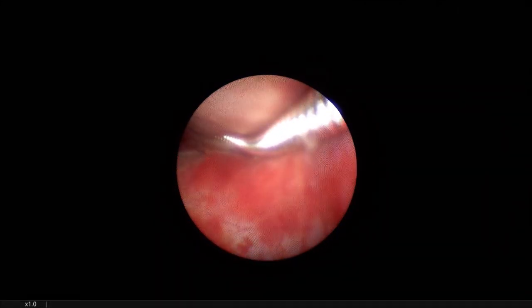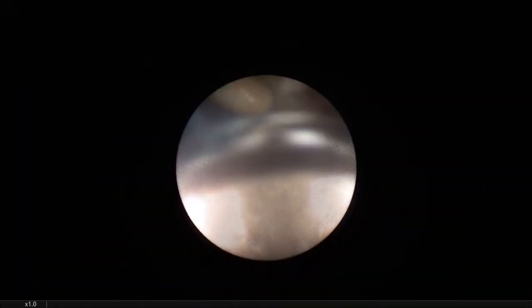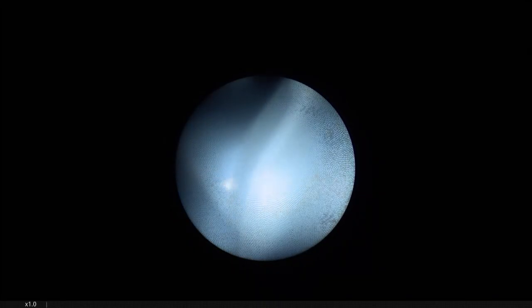Yes. There's the guide wire. But during the guide wire there is a parallel calyx. You see? Which means we make a second dilation and remove the stone. You agree? Okay, we remove the laser fiber.